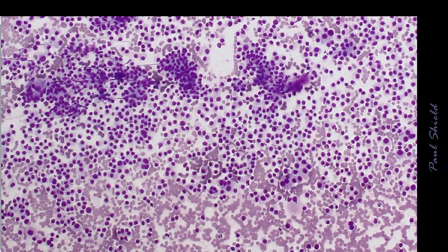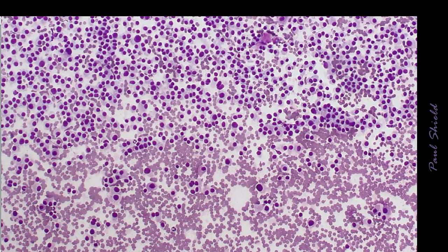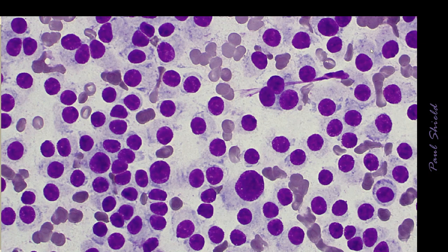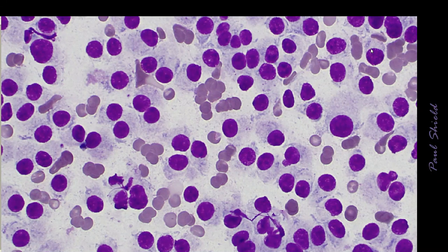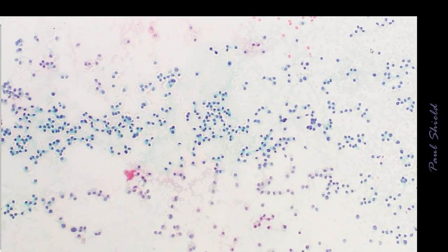So here's an example, showing a predominantly dispersed pattern. You can see the cells, even at this power, don't particularly look follicular in that they seem to have quite a bit of cytoplasm, even the single cells. It seems to be plasmacytoid, and there's quite a bit of nuclear variation. Just here, there's a little area suggesting a poorly formed follicle, but it could well be a rosette. Notice there's a bit of nuclear atypia here, so probably moderate anisokaryosis. And the cells all have a fair amount of granular, plasmacytoid, moderately dense cytoplasm with not a terribly well-defined border.